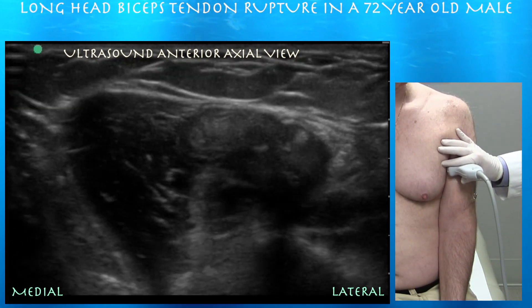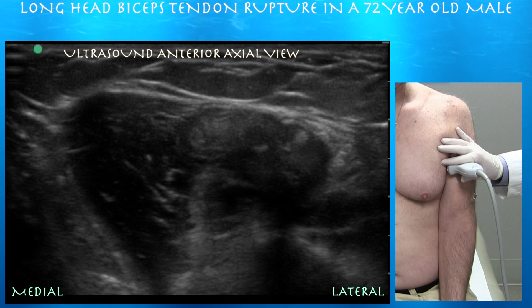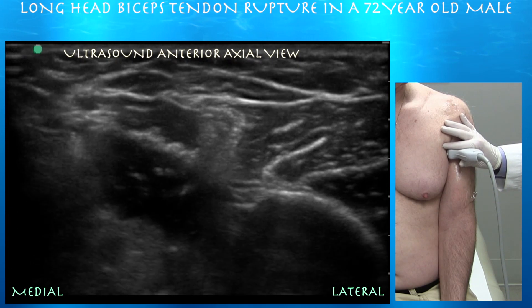Here's the tendon, starting to form. And here you can see the tendon within the biceps brachii longhead muscle. The muscle itself appears somewhat bunched up and somewhat bulbous in shape.